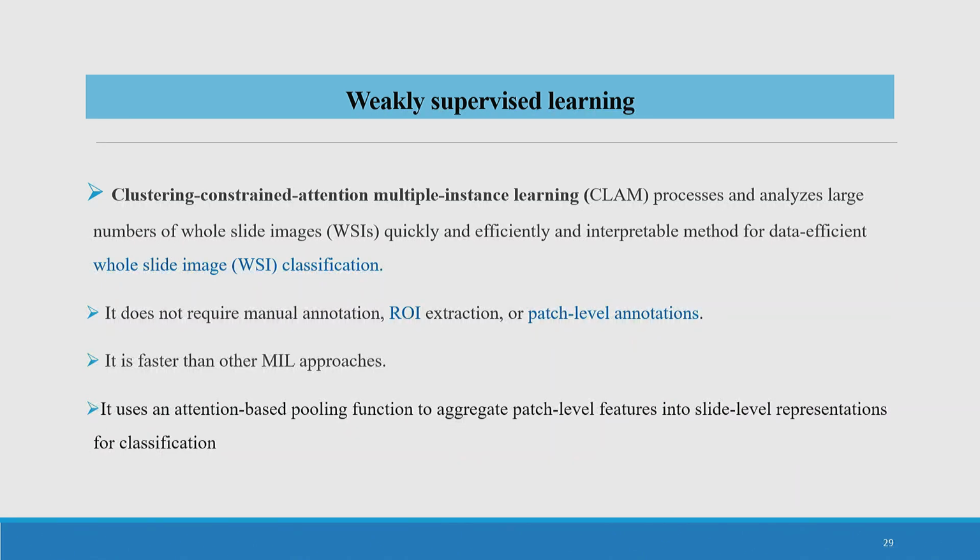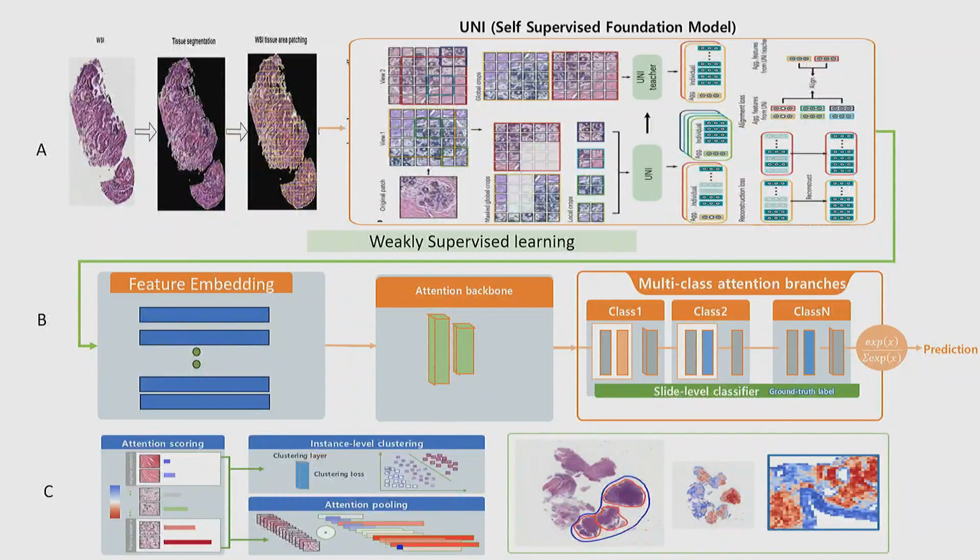When we were using, for example, MRAN, it took maybe 7 days, 5 days, depending on the number of slides we used. And we also used the SimCLR dual stream network, in which when we were training the data, it took more than 2 weeks for the training of the model. So this was one of the best approaches we found, and we tried it in our research.